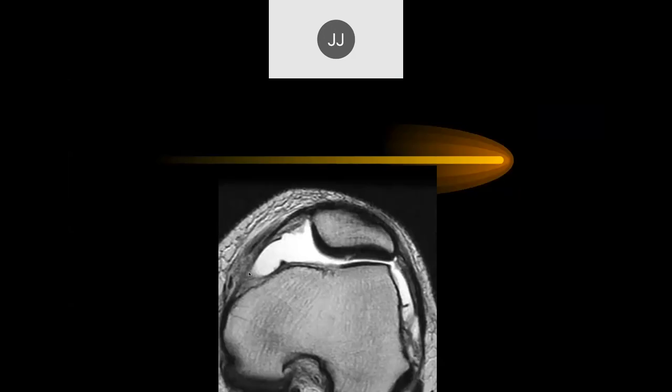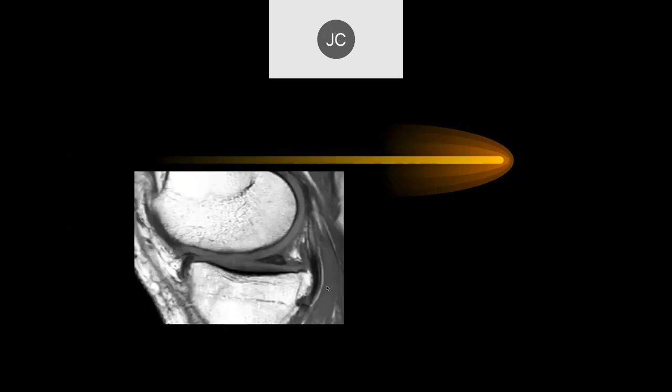On the axial of the knee, there's a small full thickness fissure of the lateral patellar facet and some dysplastic — probably a shallow trochlear groove. So that's an acute cartilage tear.